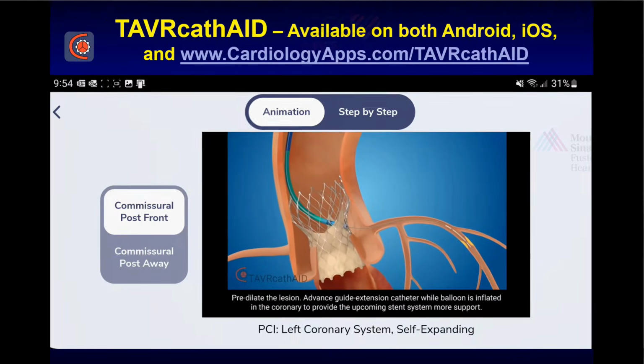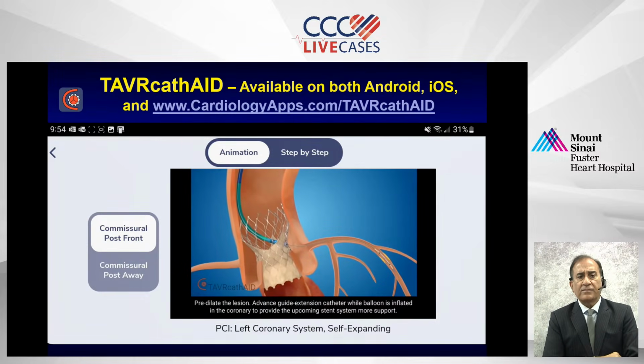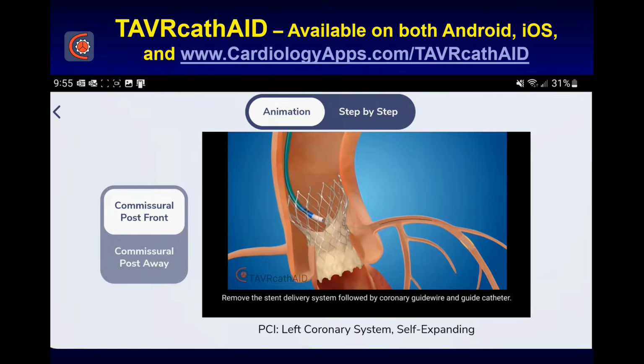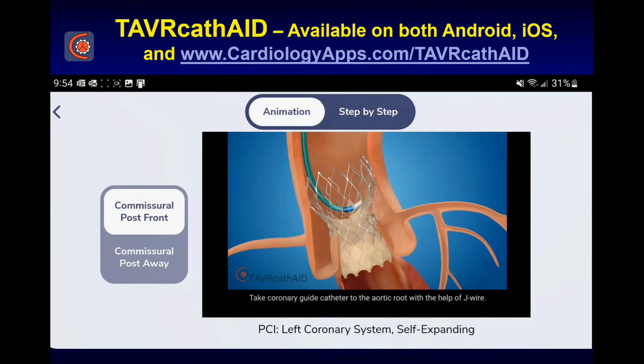Have you encountered any cardiovascular collapse in any of these cases? Yes, it happened. Yes, that is correct. The occlusion of one on the table happens, overall incidence of coronary occlusion about 0.6%. On the table it is actually more with the SAPIEN valve compared to Evolut. Outside, once you come out of it, later on, obstruction of the coronary is much higher with the Evolut compared to SAPIEN, because SAPIEN frames remain below the coronary ostia, right or left. Now, so acutely... Let's go back to what Dr. Sharma is mentioning right now, which is what is in the literature. What we have seen in practice in our hands is with the self-expanding valve.